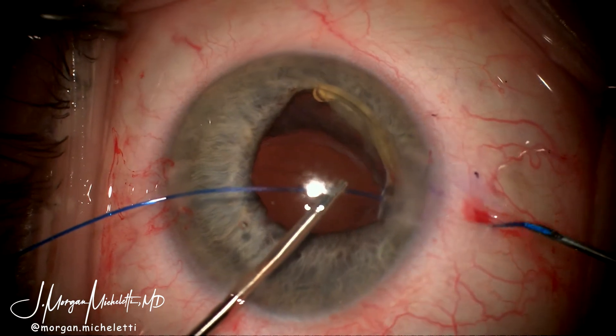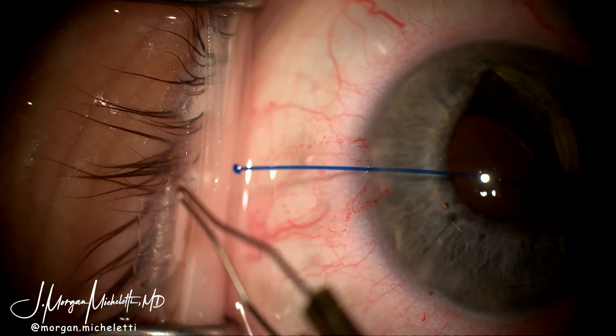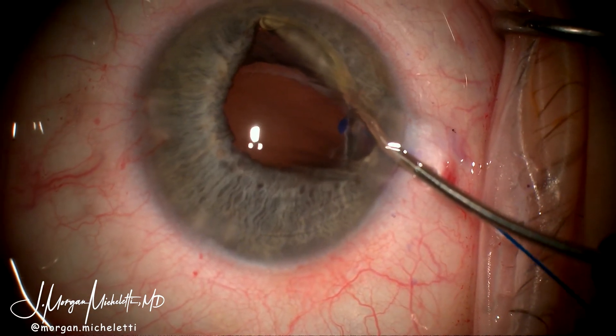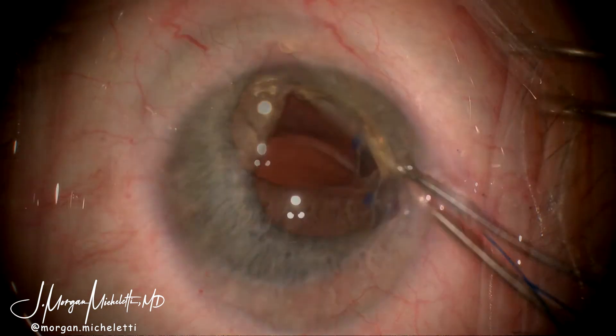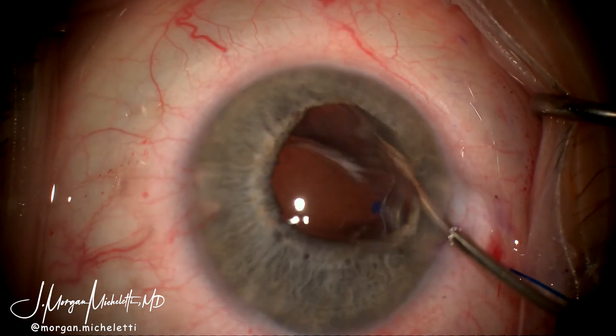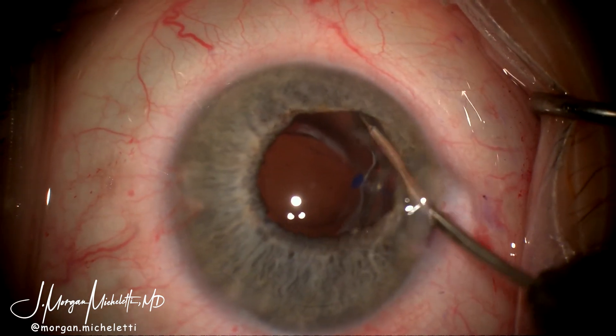After removing it through the sclera about 2.5 millimeters posterior to the limbus, I then create a flange on one side and stitch it down onto the IOL. The IOL-bag complex is then reposited posterior to the iris and some more vitrectomy was carried out at this time.